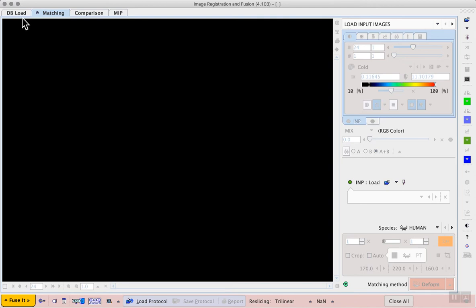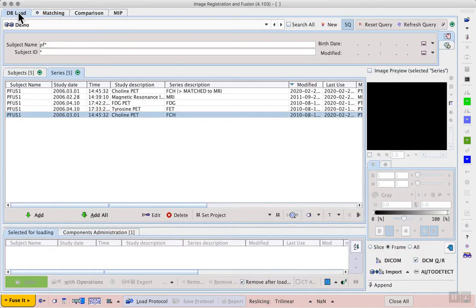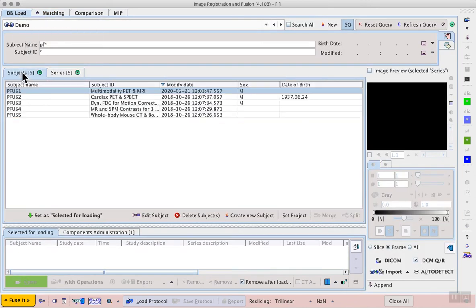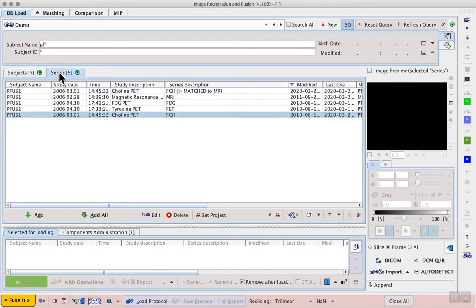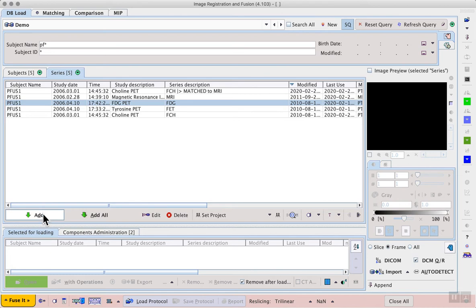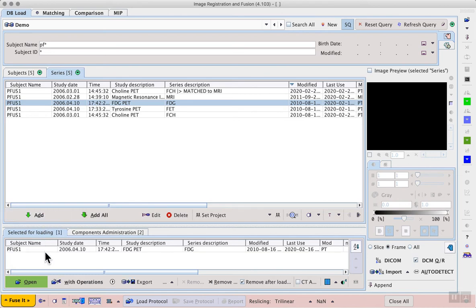And then we can go to the db load tab where in our demo database for subject pfuse1 we have an FDG PET available. We will select only the FDG PET so when fuse it opens this single image it will always place it as the input image allowing us to choose what we do as a reference.